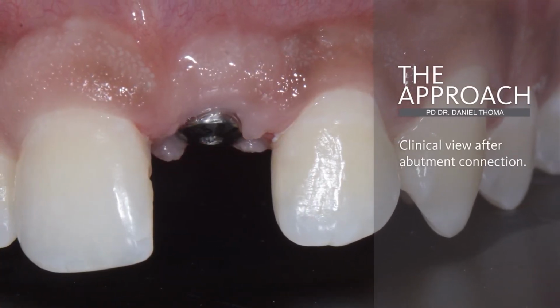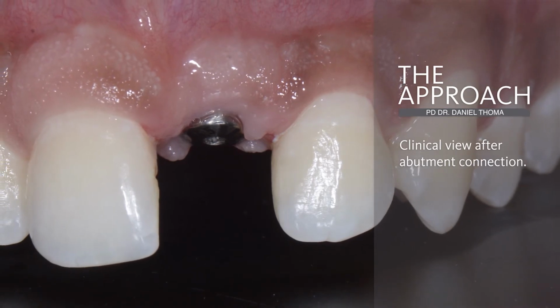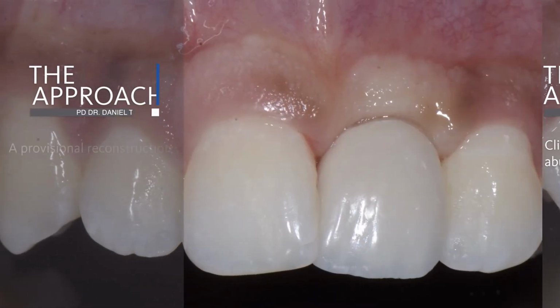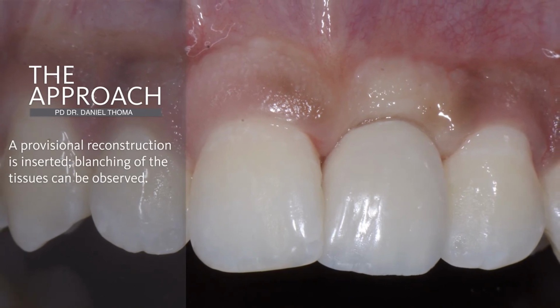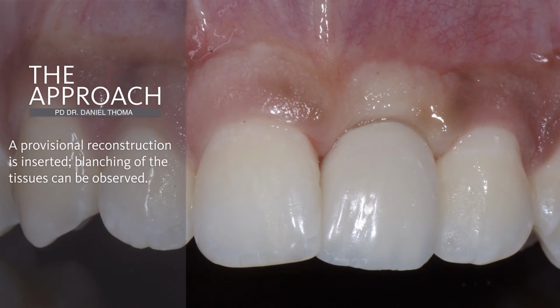Two months later, we can see a clinical view having performed abutment connection. The subsequent steps include using a provisional reconstruction fabricated by a dental technician, and by using this provisional reconstruction, we can add some flowable composite and shape the emergence profile. Here we can already see the blanching of the tissues due to the pressure of the provisional reconstruction.